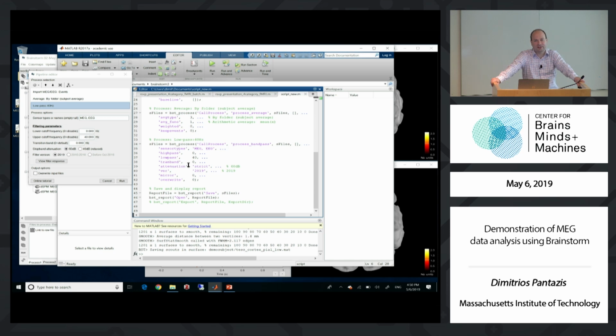They mostly base their analysis on beamformers, and they're fine. It's not my choice of analysis, and it's really hard to do other types of inverses, like this minimum norm inverse. Surprisingly hard, I would expect. Maybe I'm speaking because of my inexperience, though. So while I like FieldTrip on construction of time frequency kind of analysis or spectral analysis or even connectivity, actually, I don't like it in other aspects, including the interface and the inverses.